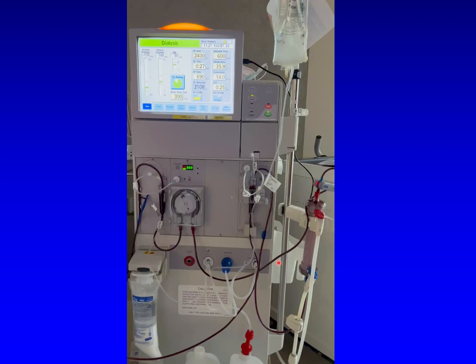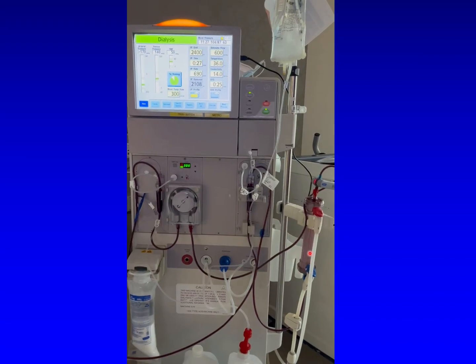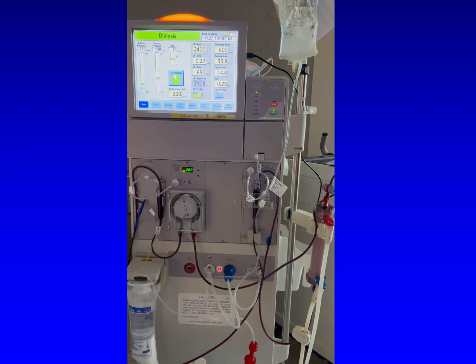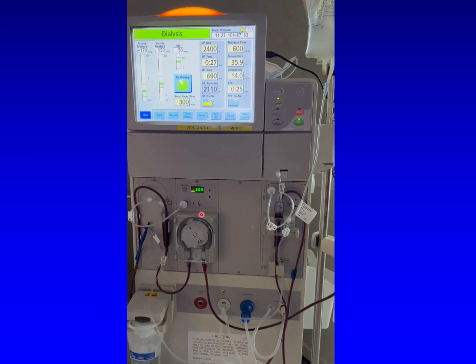Here's a dialyzer machine in action, and you can see the patient's blood flowing through the dialyzer cartridge, its rate controlled by a roller pump at 300 mL per minute.